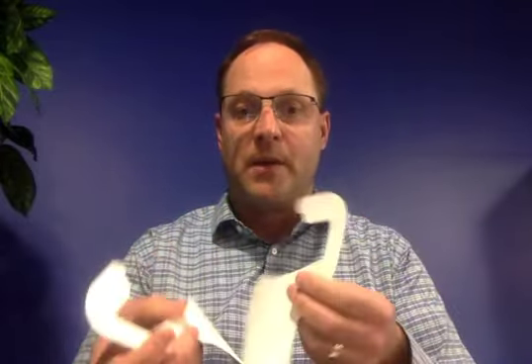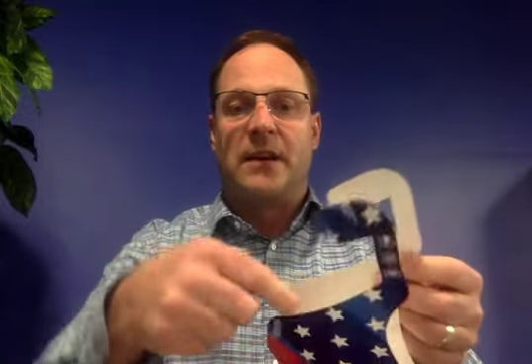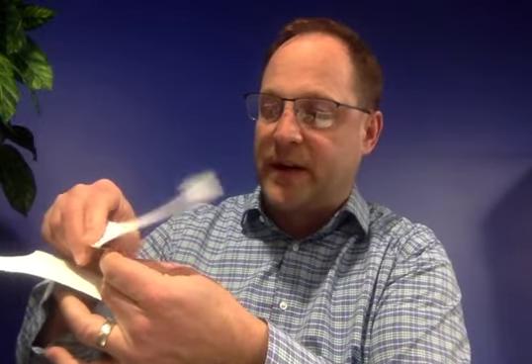So at the same time, we don't want to be touching the inside of this mask down where your face is. So before we get started, again, my hands are clean. The adjustability comes from a couple of lines here. These lines on the mask allow you to fold on the top line. It allows you to make it so it fits a smaller size face and fit a little more snugly.